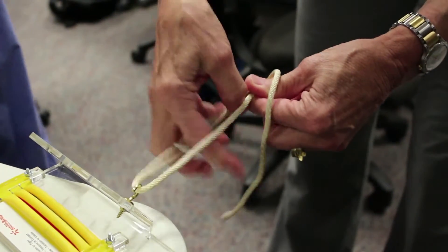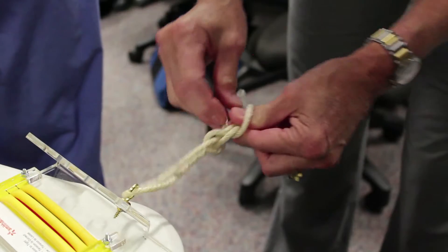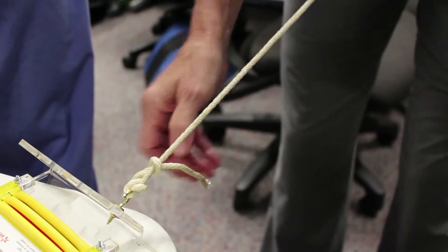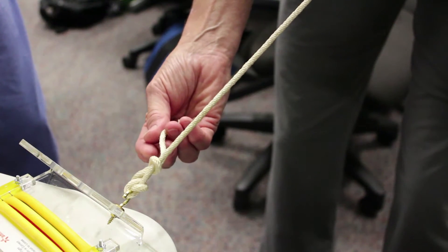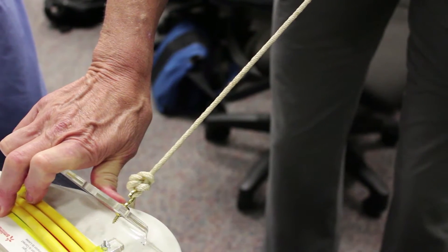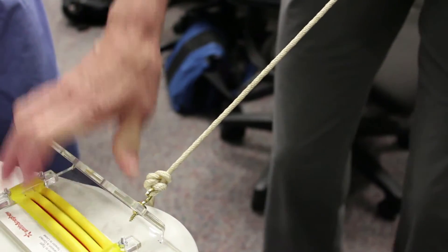I put my thumb here and go there, there, there, and then pull it down. It's a bit short, but if you want to let this go — your loop limb — and then if you pull down, then you've locked your sliding knot. So you've locked it here.